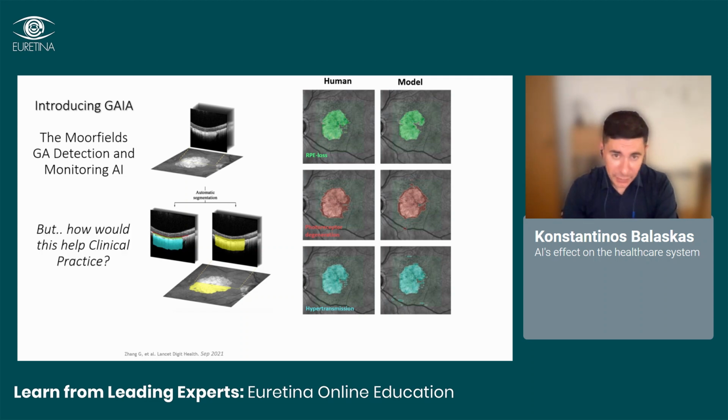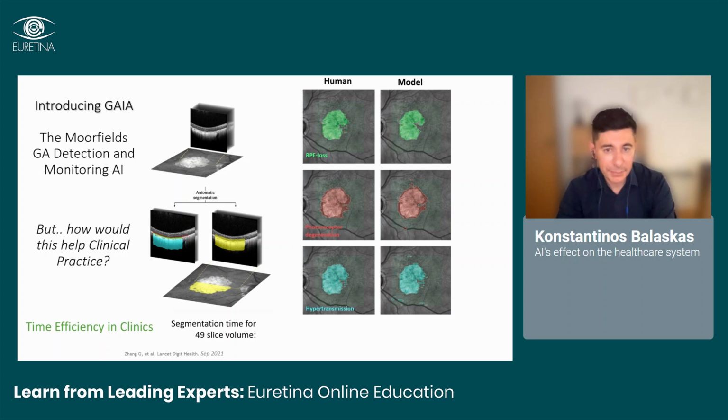But what is the benefit of such a model? Well, first of all, it's time efficiency. Segmenting 49 B scans for three features each, and then taking the overlap of those to define the presence of geographic atrophy, and then taking all of these B scans and projecting them on the corresponding en face near-infrared image of the Heidelberg to produce a surface area of atrophy and of the individual constituent features, is something that can be done uniquely at speed and at scale with the help of AI.